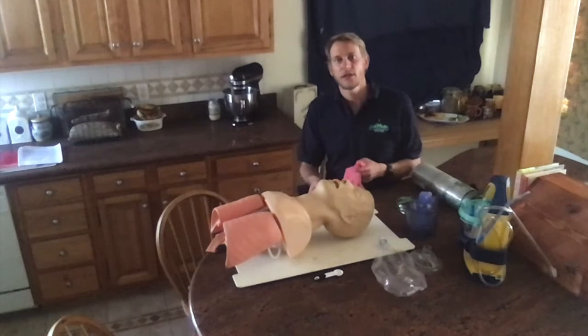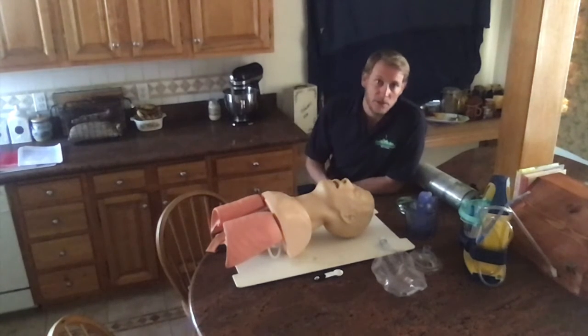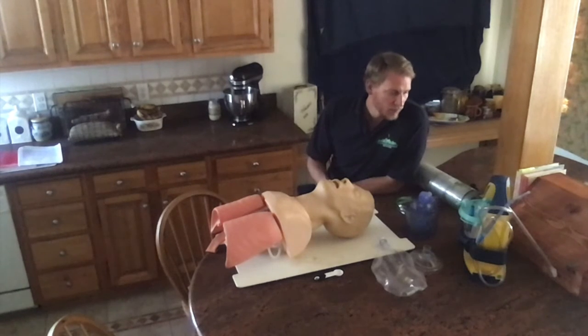We have another edition of NREMT Skills Assessment: BVM Ventilation of an Apneic Adult Patient. It's a quarantine edition — we're working from home.